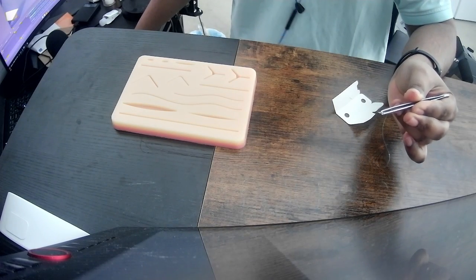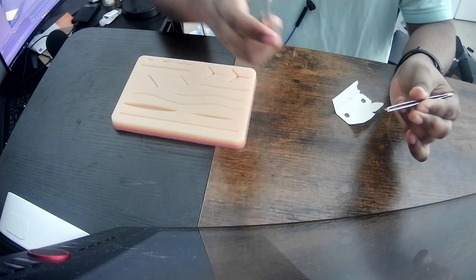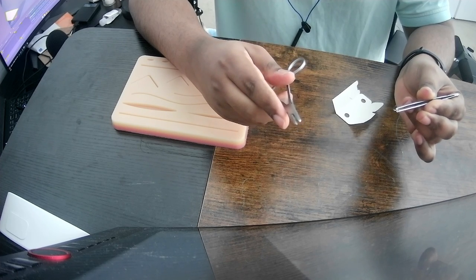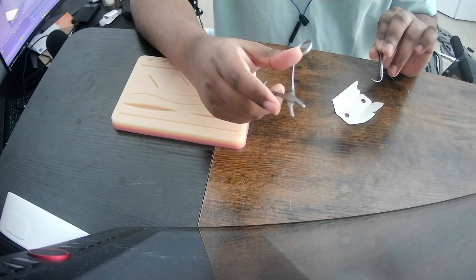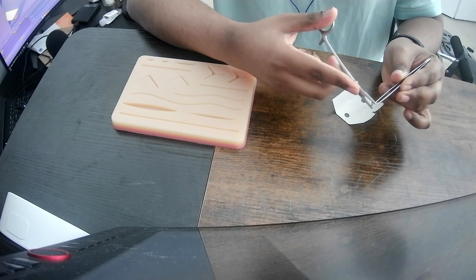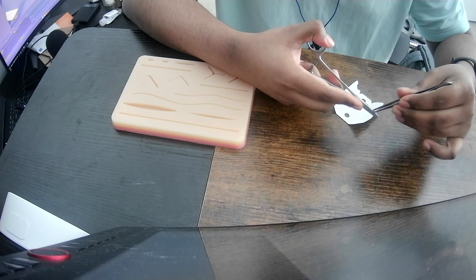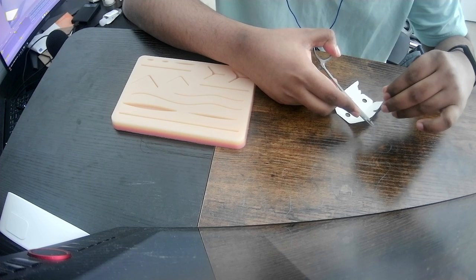You're loading, but I would argue they're very, very important. As you look at your needle, you're going to have a lot of different types that you're loading, but they're all going to more or less be in this curved pattern. You are free to load the needle anywhere on this curved pattern. And there's benefits and obstacles that occur with your positioning depending on where you choose to load it. Now, just to start, we're just going to load it in the middle, just for simplicity's sake.